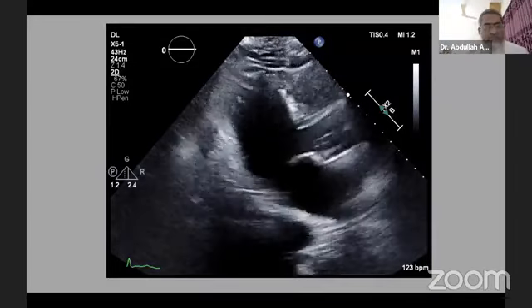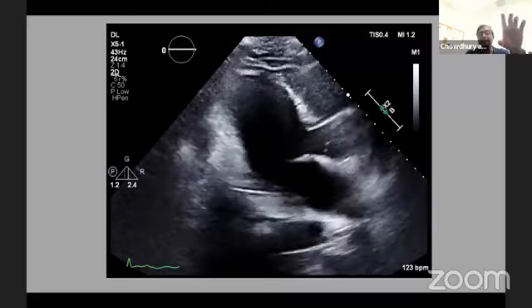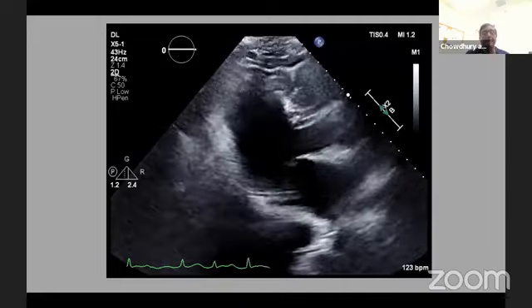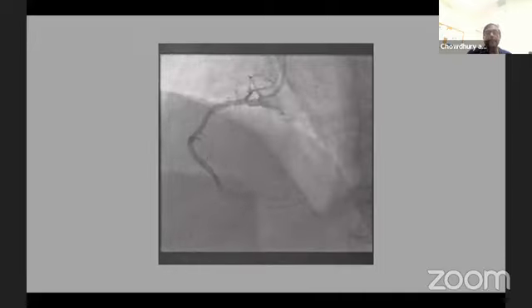Yep. And also I tell you, we look at the aortic root quickly and then AI. I tell my fellows to make it a habit, the aortic root, good, there is no dissection you are dealing with. Just a brainstem reflex. And then we did this cath, and funny enough, then they did this, and then they looked at this, and then happy ending.